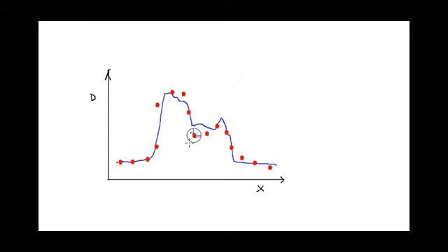Let's look at this point. Does this point pass? No, it does not, because it's not within that circle. Let's go to the next point. That passes. It's within the circle. Third point. That one's just at the edge, but it doesn't pass.